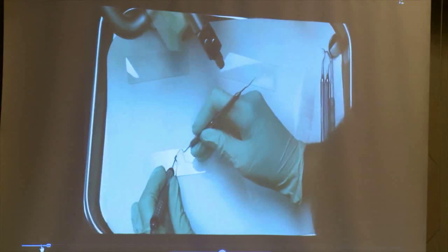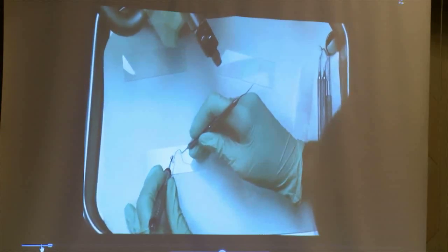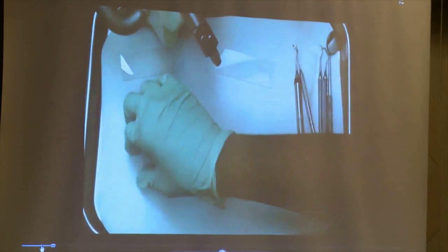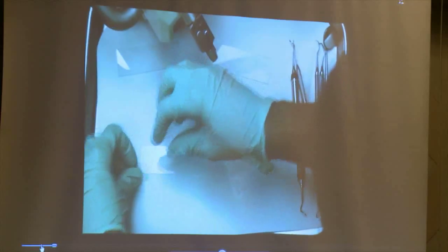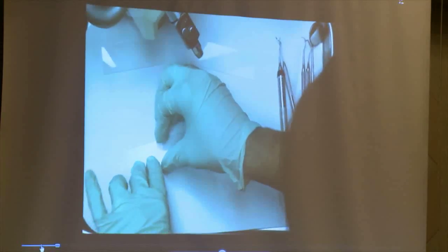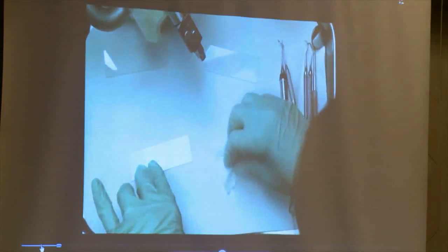Some of the bacteria that live under the gum line and putting it on a slide that has distilled water on it. Then placing a cover slip over it, and then turning it over to remove as much of the air pockets that we can.